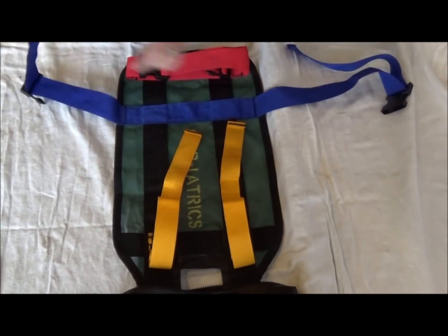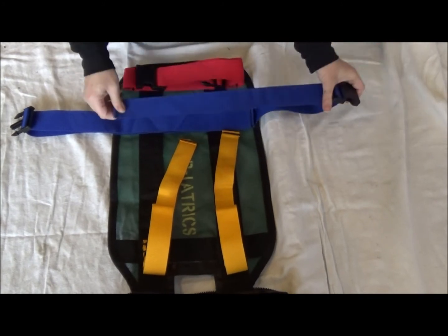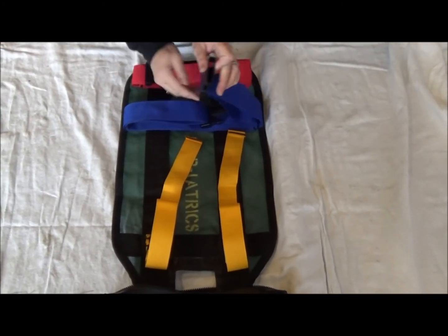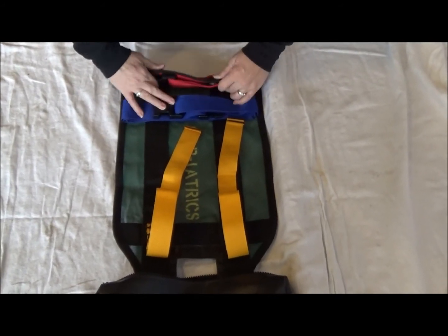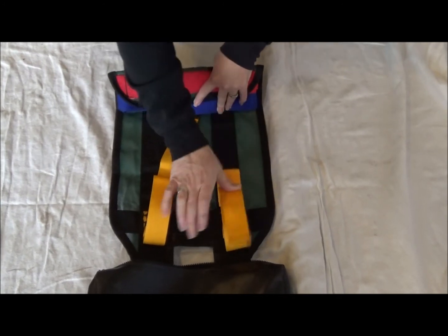Start by folding the red and blue straps together as shown. Fold from the end as shown and tuck the yellow frame straps in so they are wrapped into the bundle.